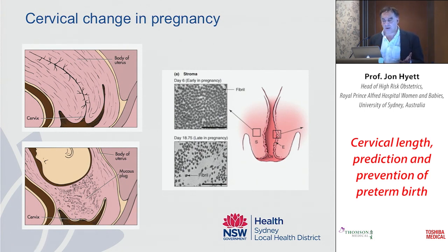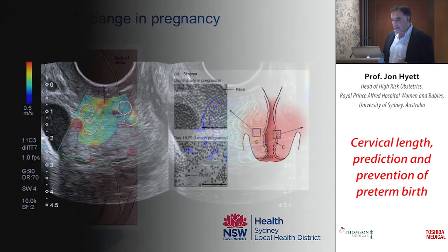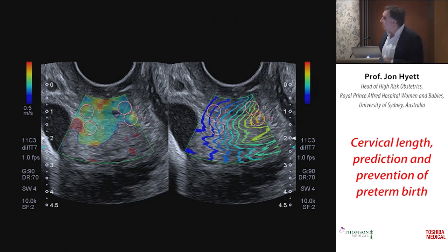So the question is, do we have a tool where we can assess softening as well as a tool where we can assess length? And this is where the elastography potentially comes in. So we've been doing some cervical elastography. We've been doing this on and off probably for about 5 years now. We started using a variety of different technologies that use strain. The problem using strain, in fact, is that you are obviously applying individual operator pressure to the cervix. That's where the strain comes from. And so that would be different with each examination that you do. So trying to establish a method that you could actually use that was calibrated across patients is very, very difficult.